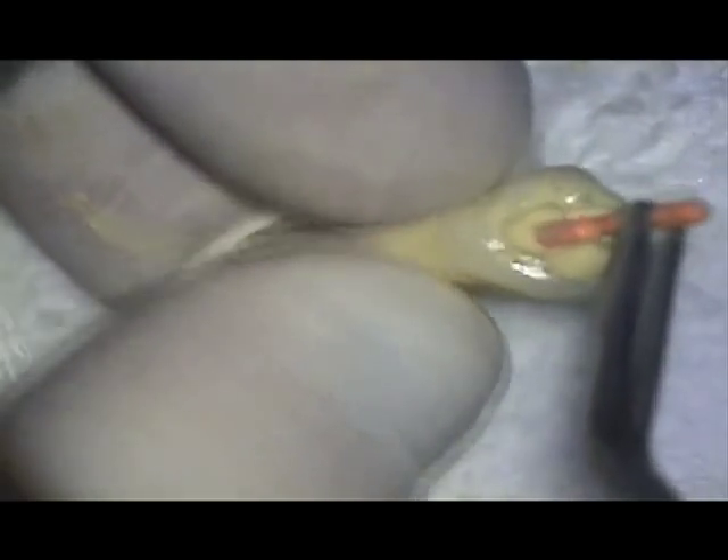Because this canal is wide buccolingually, I use a spreader with a force never exceeding the weight of my hand to create a lateral space for the placement of additional well-coated gutta-percha points. I may add one or more depending on how oval the canals are — obviously, the more oval, the more lateral points placed. The more points I place, the more shallow the spreader depth of penetration for each subsequent point. The important point to remember is to never exceed the weight of your hand as the force applied to the spreader.